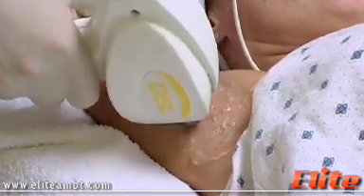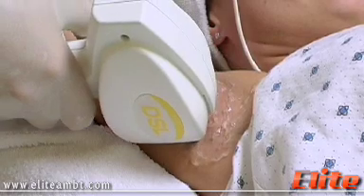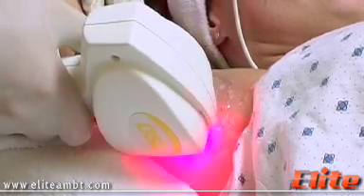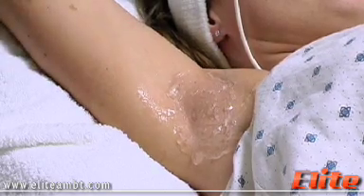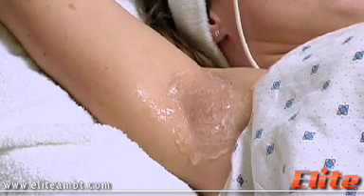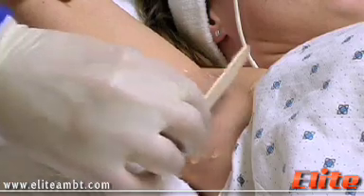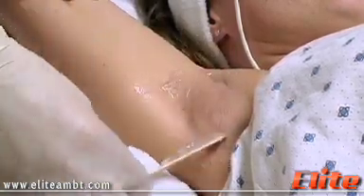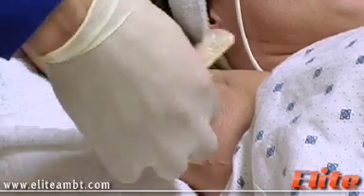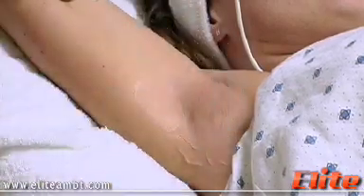And this is our last pass. And that's it for this side. We'll remove the excess gel. And with a few more consecutive treatments we should achieve permanent hair removal.